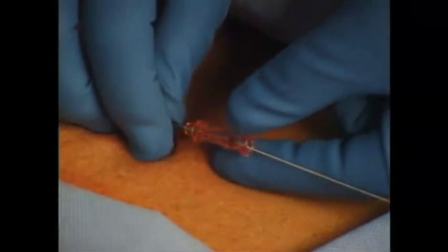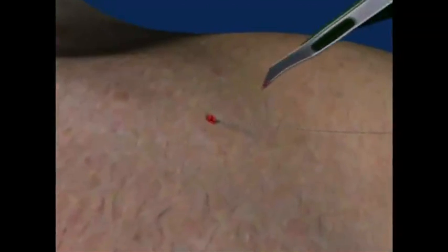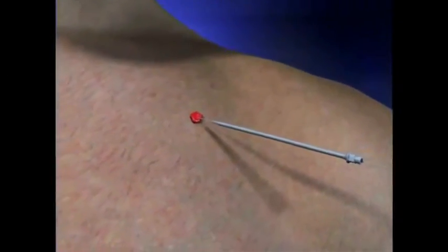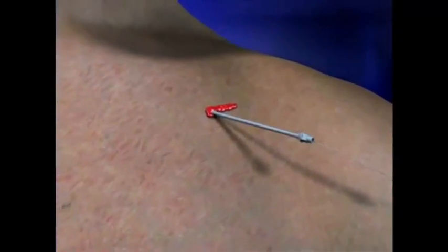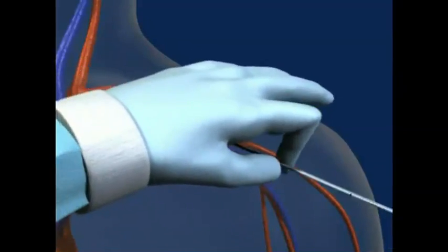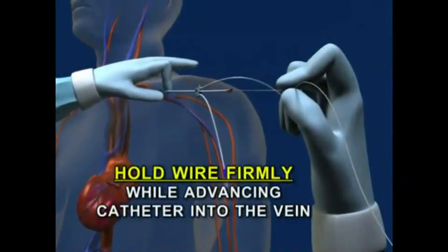Once the guide wire has been advanced almost completely, the needle is carefully removed. A number 11 scalpel is then used to make a stab incision in the skin immediately adjacent to the wire. The dilator is then used to dilate the track where the catheter will be placed. There will be increased bleeding after dilating, so gentle pressure at the insertion site is often helpful. The catheter is then threaded over the wire into the vein. It is extremely important that the wire be advanced all the way out of the catheter until it exits from the brown hub before beginning to advance the catheter into the vein. It is absolutely necessary that the wire be held firmly while the catheter is advanced to prevent the wire from being lost in the vein.